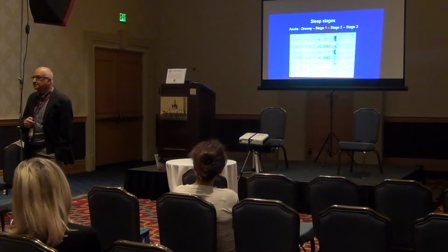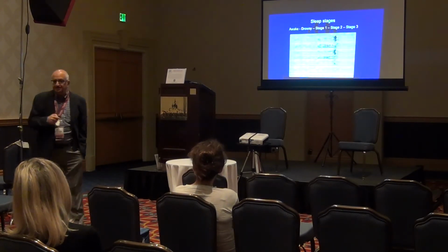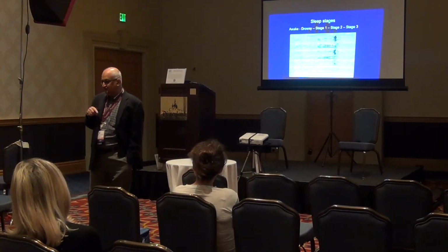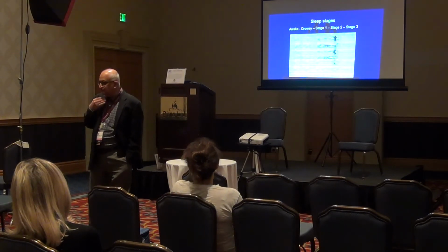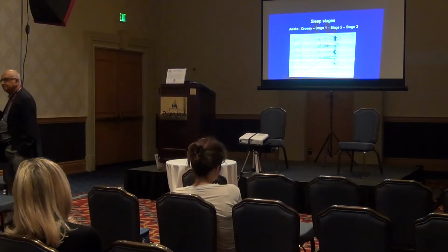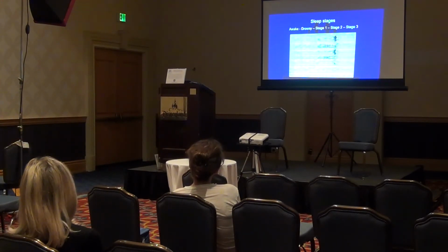That is complete crap. It's not serious stuff. See, brain activity doesn't look that sharp. What that is, is muscle activity. Right? You'll see eye blinks, you'll see chewing artifacts. So the hardest thing in reading an EEG is actually to know what is real and what's not.